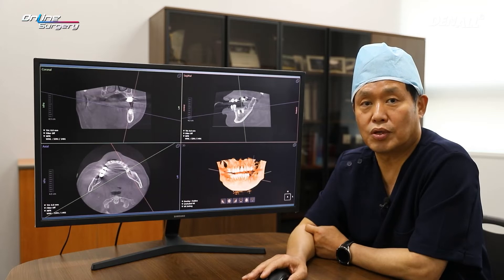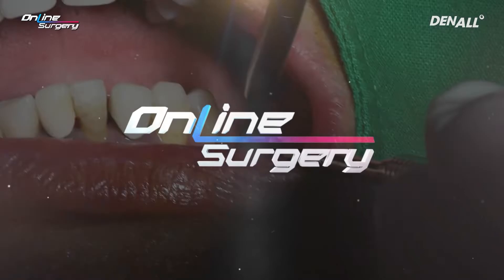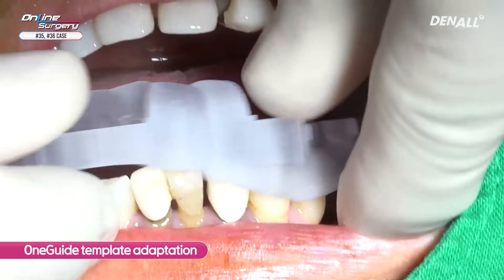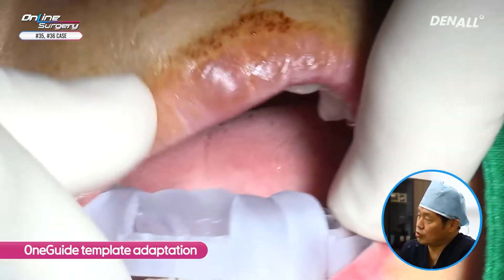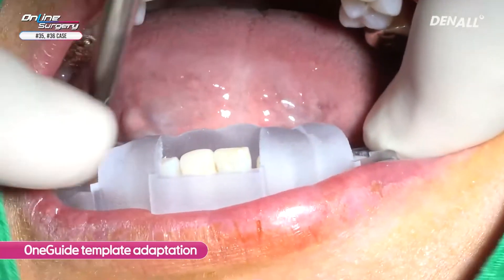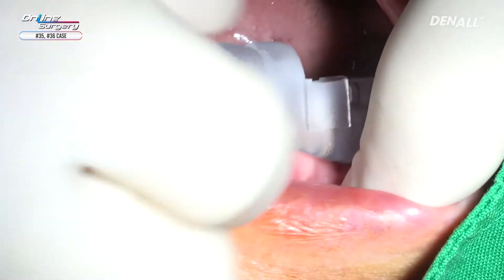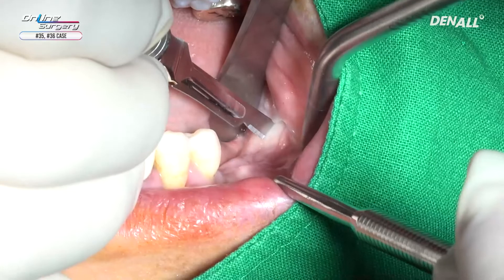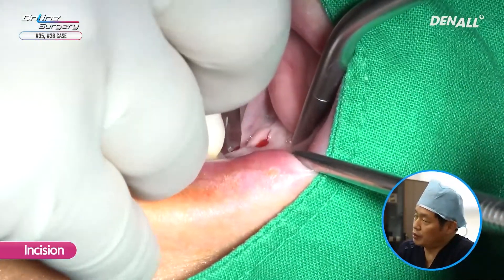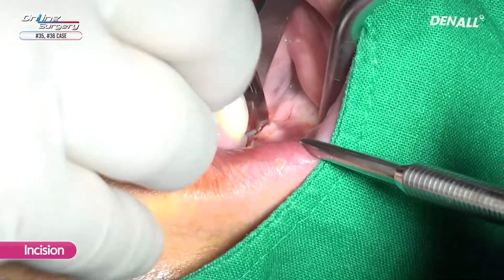Let's look at the surgical video. The one guide template was checked once again to confirm it fit well — I also verified this before surgery. There was insufficient attached gingiva and GBR was planned, so although one guide was used, an incision was made and surgery proceeded with a slightly reflected flap.